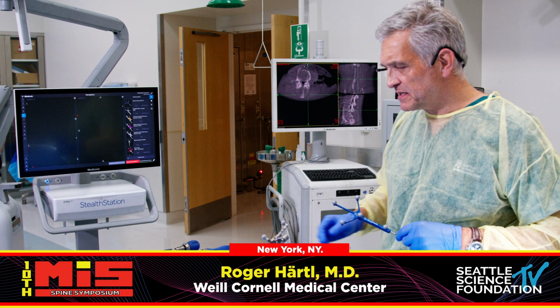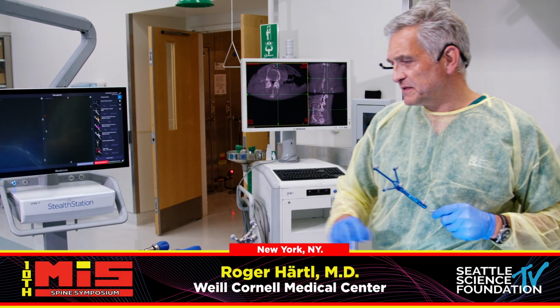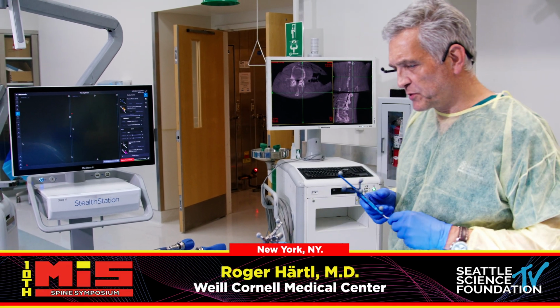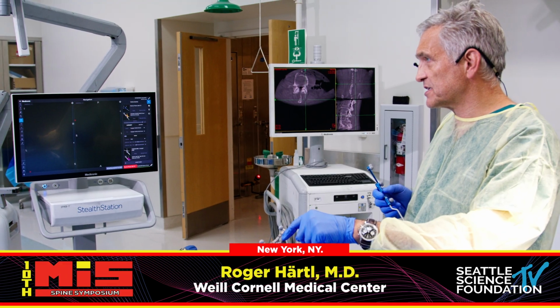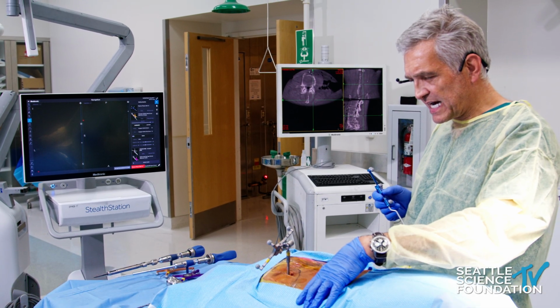Lumbar spine here, the bottom is here, the head is, so cranial is towards my left up here, caudal is towards my right. We already put the reference array into the iliac crest on the contralateral side. So this is the left side, this is the right side.